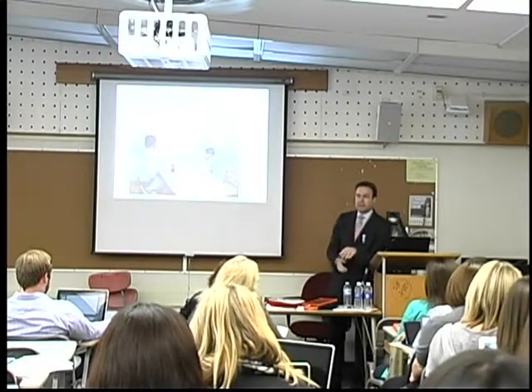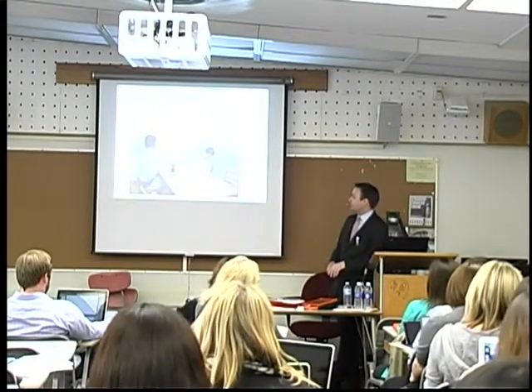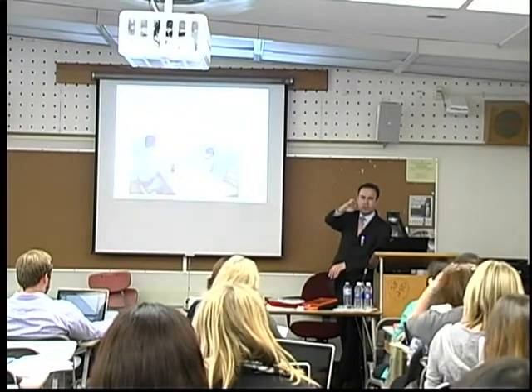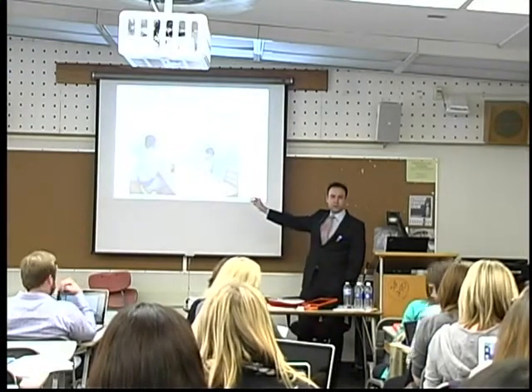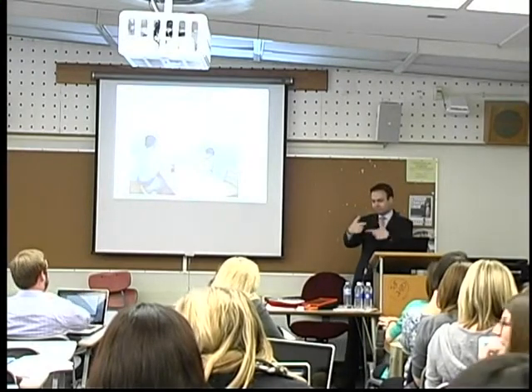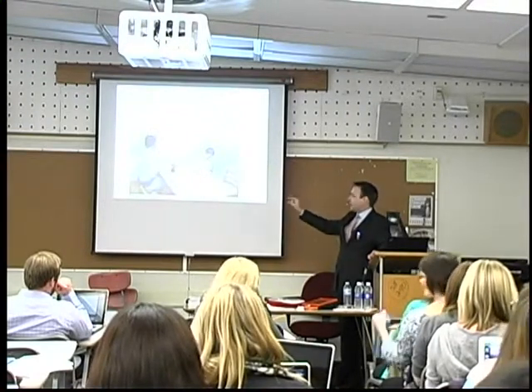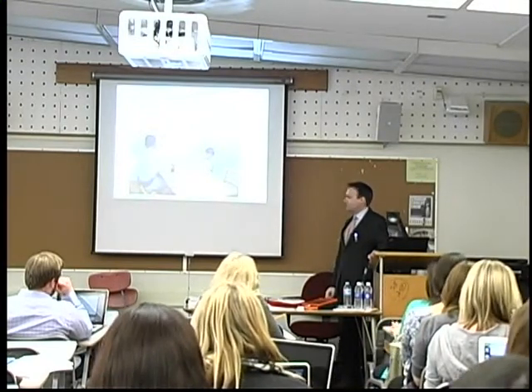It's a good design idea. I don't have so many resources to do all types of versions like I wanted to, but it might be a good idea for another feature if people have gotten to this stage and now want to see this on the top. And if it's on the top, then maybe the communication partner can also more easily see what that person is trying to communicate. In a future version, we could give you the ability to switch the location of that sentence strip from the bottom to the top. I mean, this is pretty flexible.